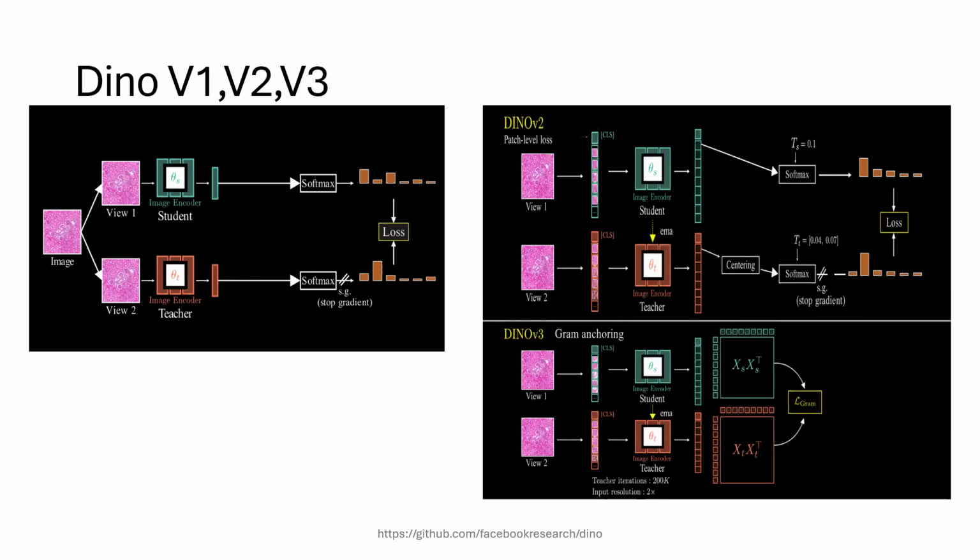Like in medical imaging, PCA and UMAP are both important, because you have to visualize everything. So people who are working in medical imaging should have a lead in clustering, harmonization, and PCA. These are the three important categories, because if you have to visualize everything, you should understand this.